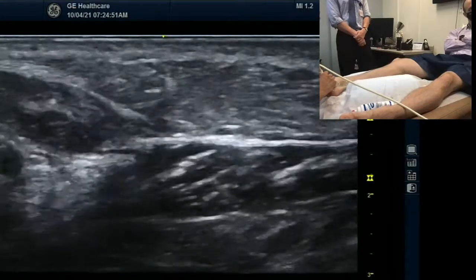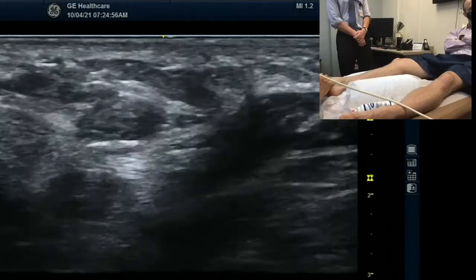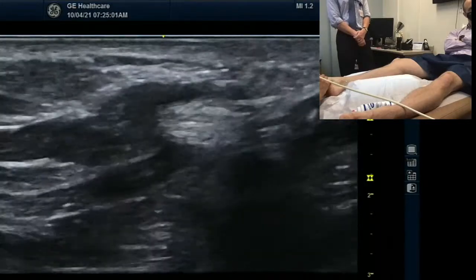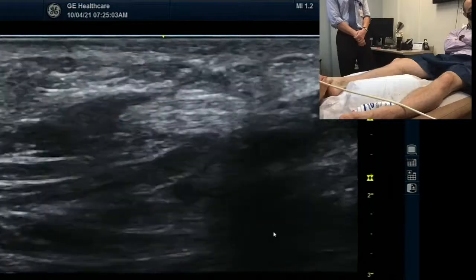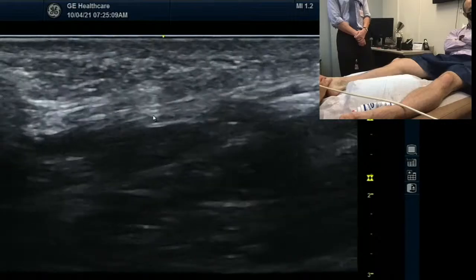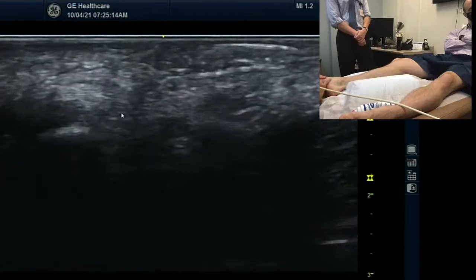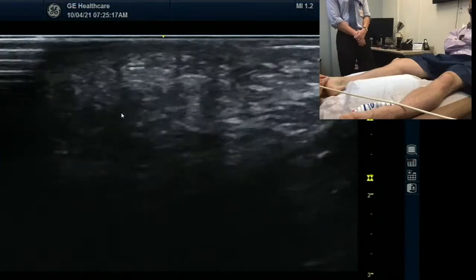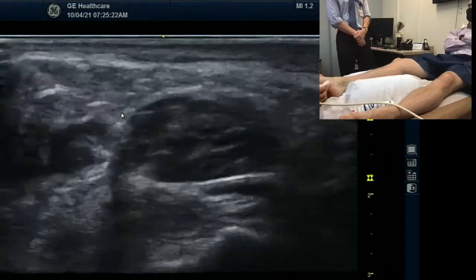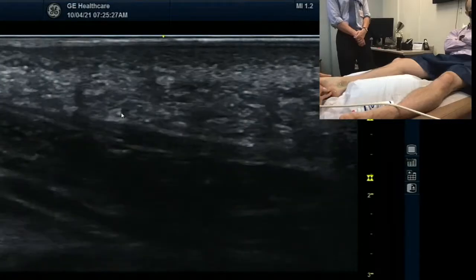I want to follow that. Can you follow that one? And there's diving — diving. Then it goes one to three and a half, right? One to three and a half. Yeah. I like that it has a little bit — it has the analog to the median and ulnar distributions. Very simple, just like three and a half. It's a little bonus. We can look at his plantar fascia.